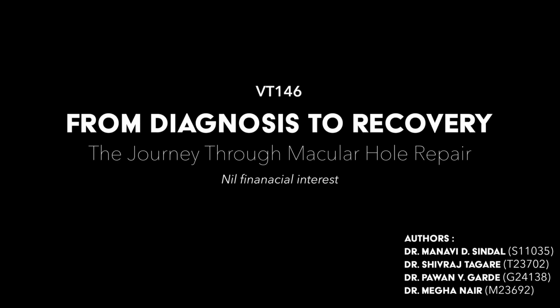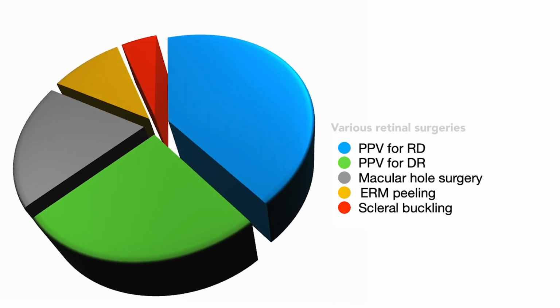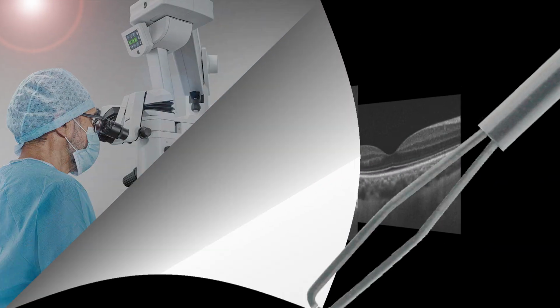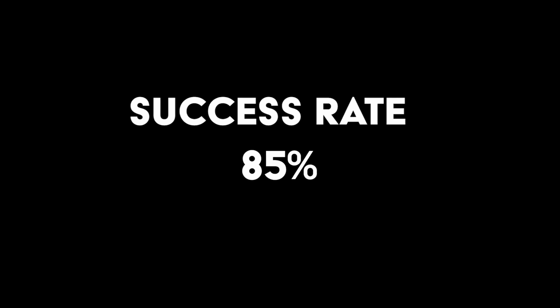From diagnosis to recovery, the journey through macular hole repair. Macular hole surgeries rank among the most common vitreoretinal procedures performed today. With continuous advancements in imaging and surgical equipment, the outcomes of macular hole surgery are improving steadily.